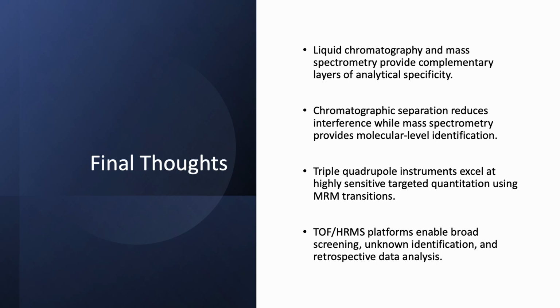Triple quads excel at high sensitivity targeted quantitation using MRM transitions, and that's still kind of the bread and butter of many of our quantitations in clinical laboratories. And then time of flight instruments are enabling screening for unknown identification and allowing retrospective analysis, which is a valuable tool in some clinical contexts.